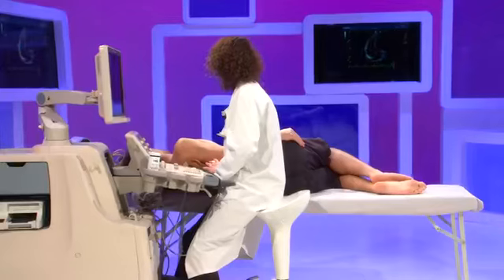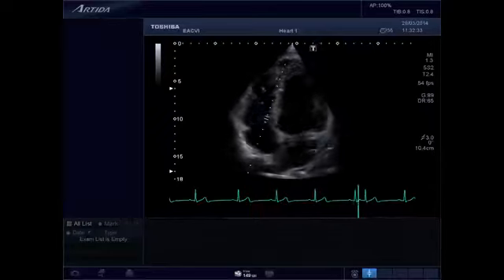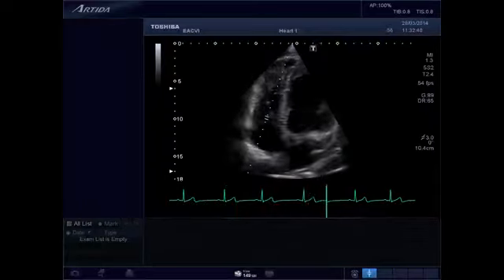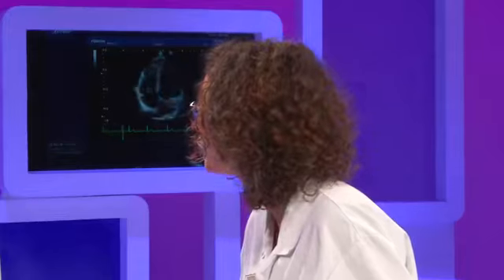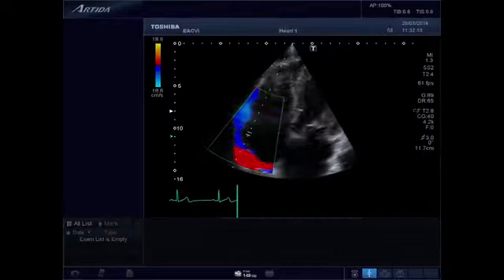So now I can try to assess the systolic velocity of the tricuspid annulus. And for that, I will go back to the tissue Doppler in a pulse wave modality. So again, I'm trying to be parallel to the movement of the wall, which is not always easy. Okay.